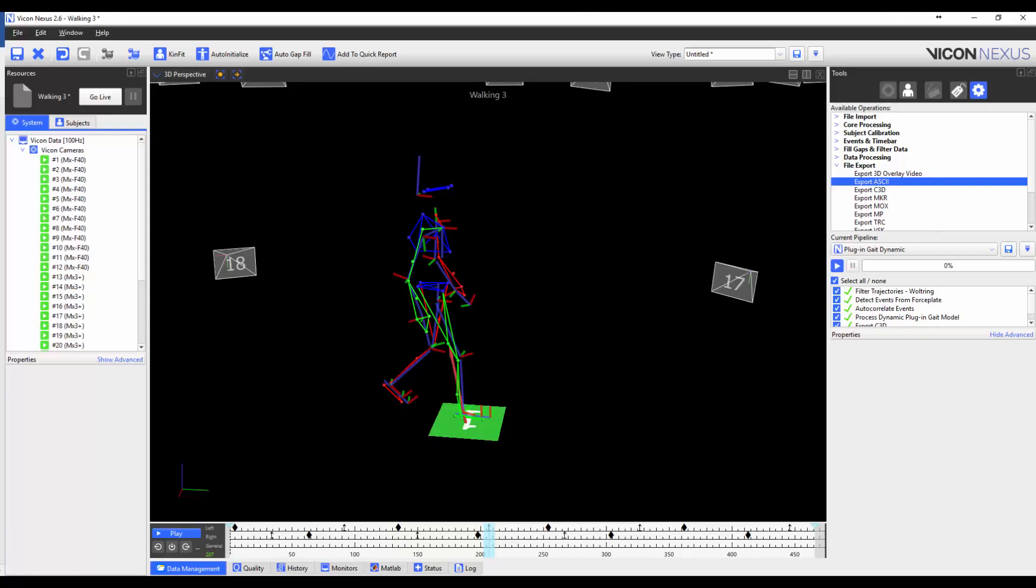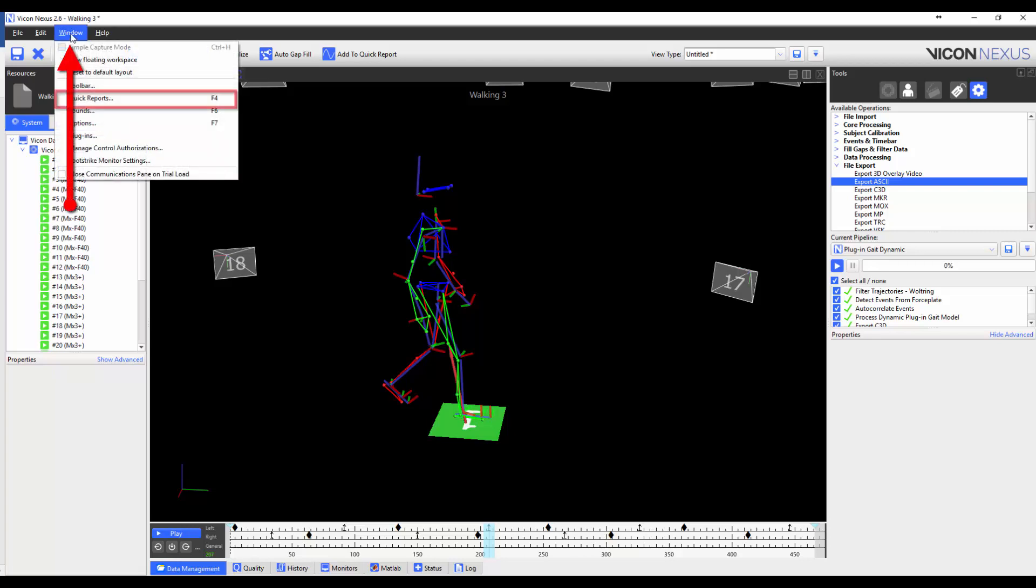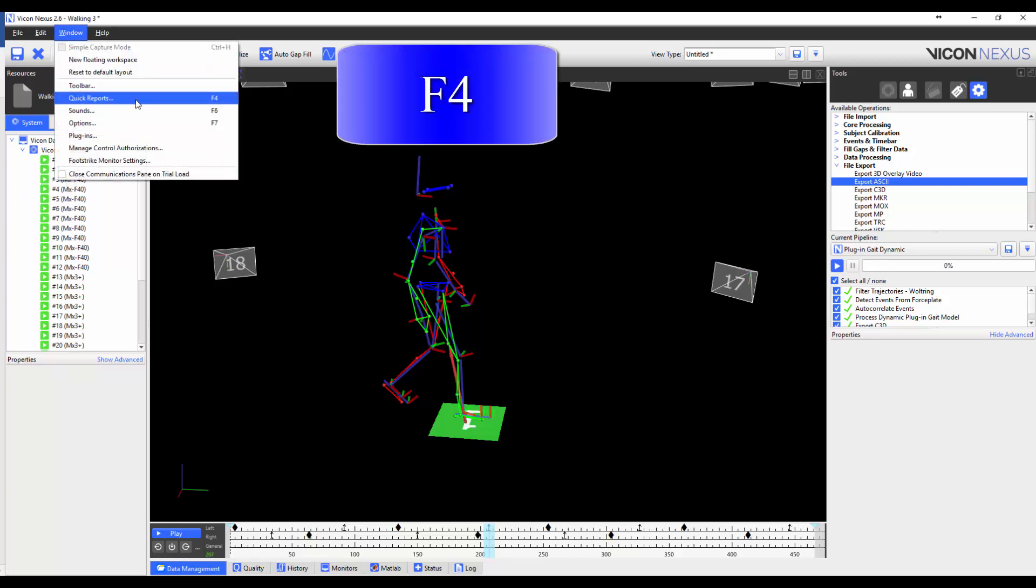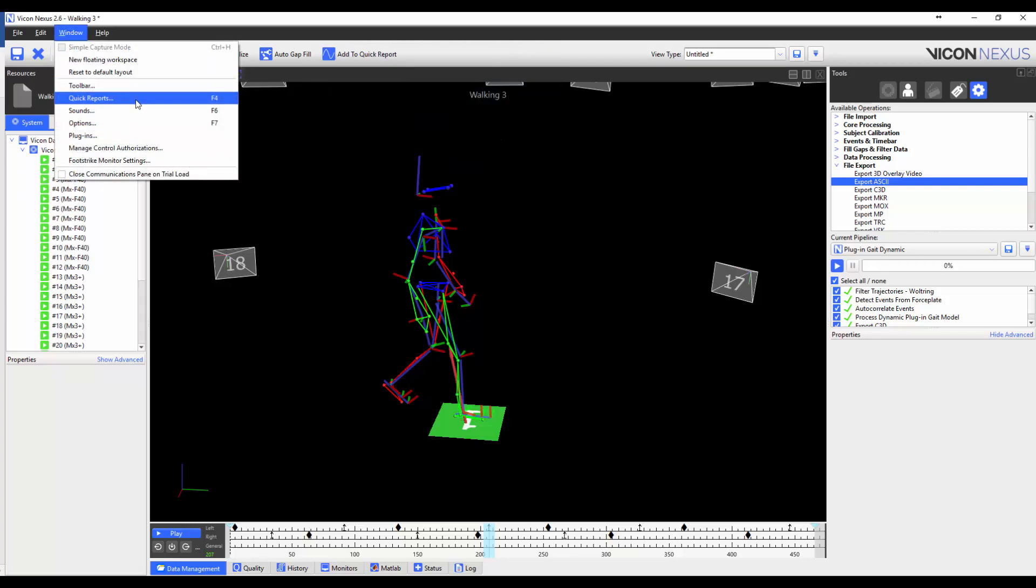Quick Reports is a quick way to view multiple model outputs across different trials. To access Quick Reports, you can either go to Window, Quick Reports, or press F4 on your keyboard.